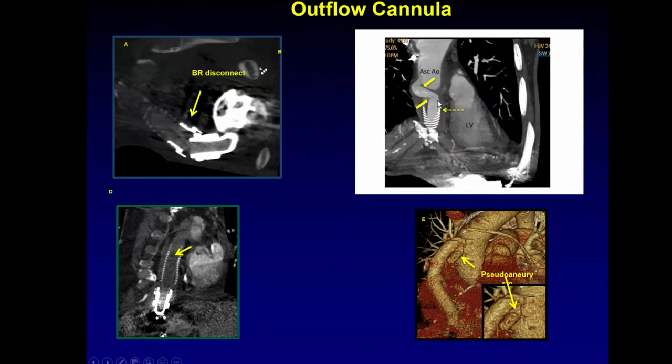Remember that the LVAD is placed with the chest open. So once you close the chest, sometimes there could be not enough room and you can cause kinking. Fortunately, this is very unusual, and out of several hundred cases we've seen, this is probably the only case of severe kinking that we think could cause some type of hemodynamic compromise.